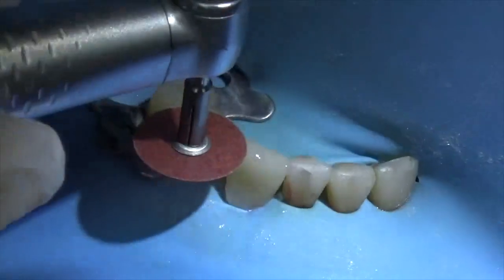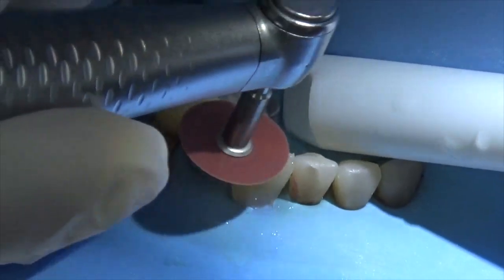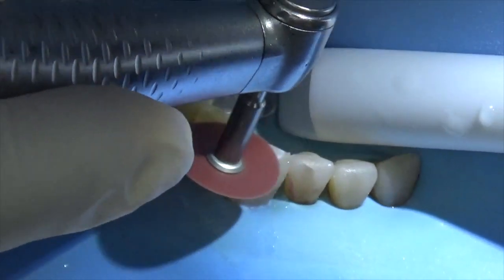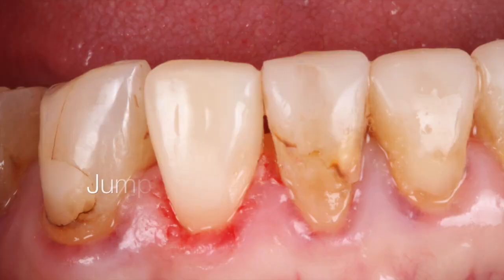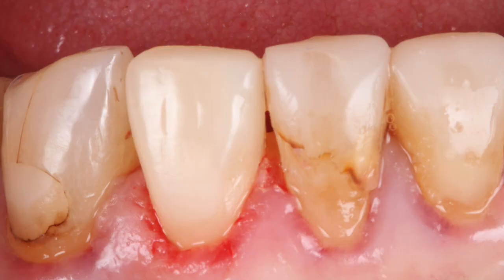They're basically a monoblock of composite. I take everything out, and because this restoration is right near the gingiva, I can't do much trimming with the rubber dam on. But I can get the incisal edge correct — just running the disc from one tooth to the next. And there we go: a finished restoration, seamless, no joins.